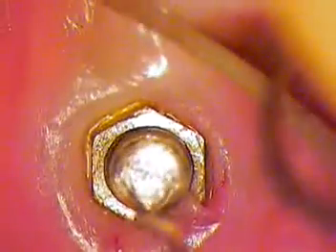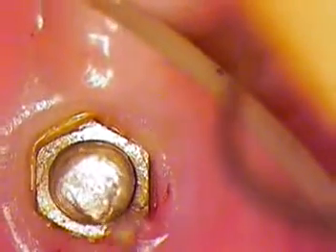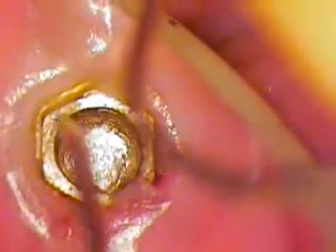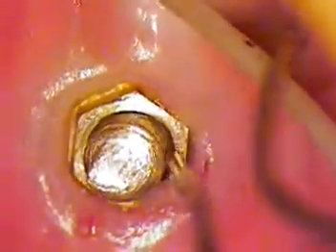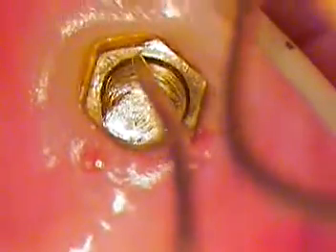I'm going to increase the magnification. So everything's the opposite in my mind — here it looks like I'm going counterclockwise, and that's exactly the direction. You can see how when it fractured, the tip broke on the clockwise. So now we're going counterclockwise, just the opposite.